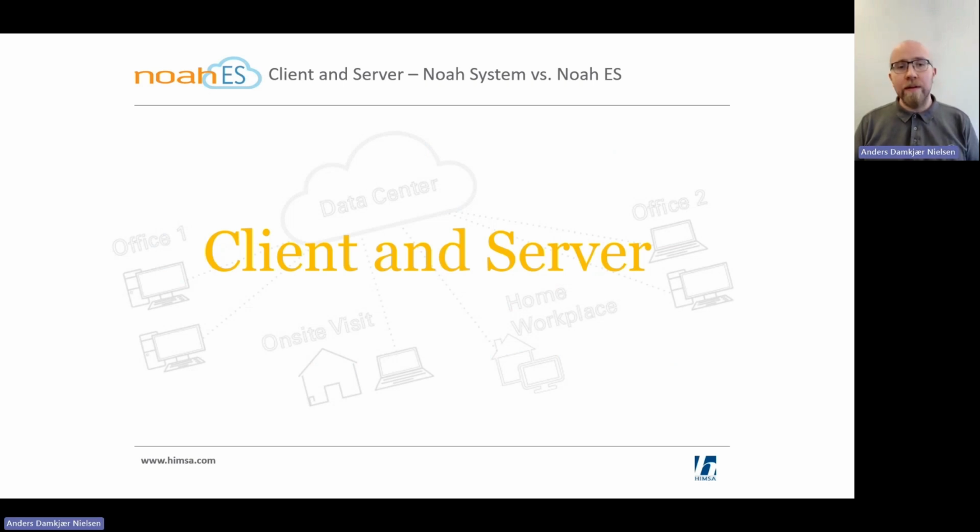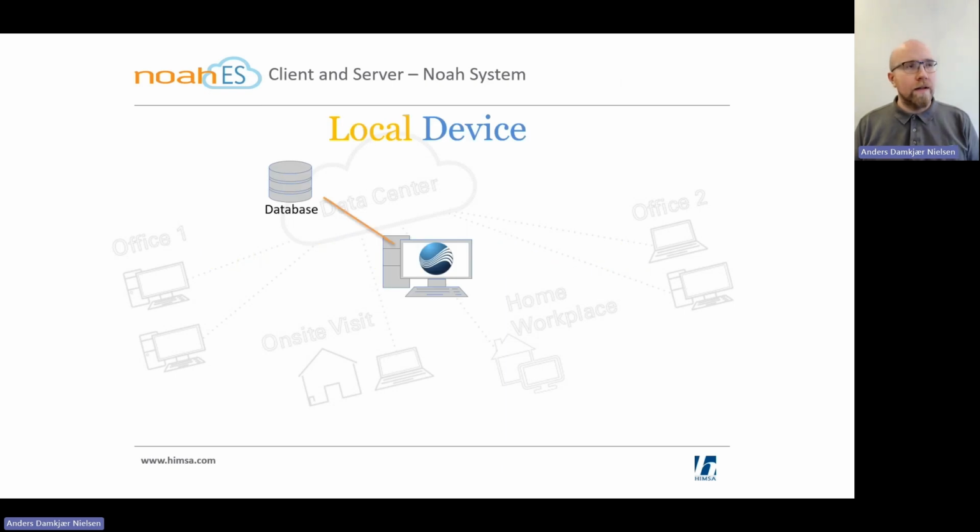So, moving into the actual topic of today, talking about client and server. It used to be with Noah System that you'd have a local device. That local device would have a database which would be stored on the local device. This works quite well if you have a small shop. If you have a small shop and only a single device, by all means, you can have a server right then and there.